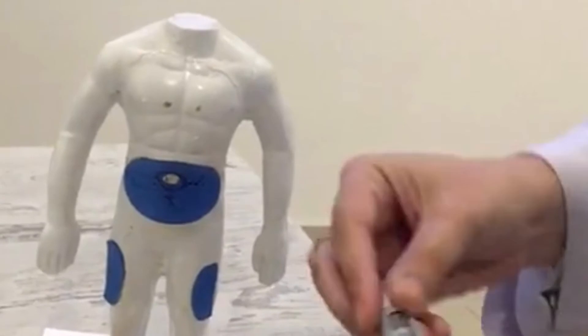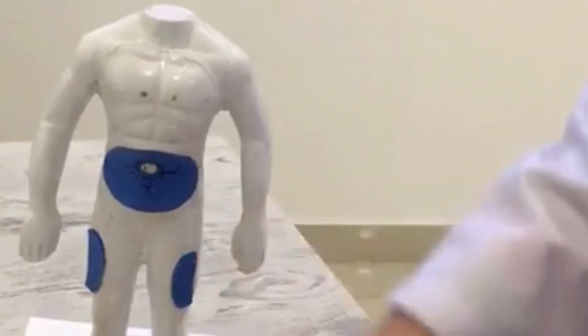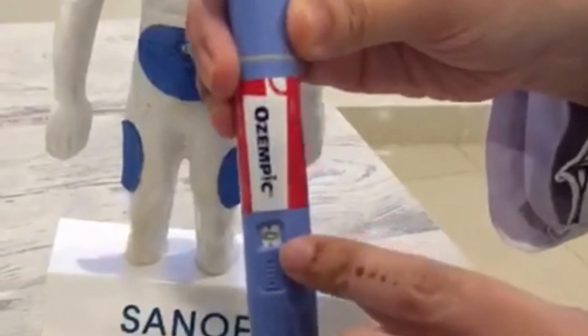After injecting the medication, remove the needle and discard it in a bin. Keep the protective cap on the pen and store the pen in the refrigerator.